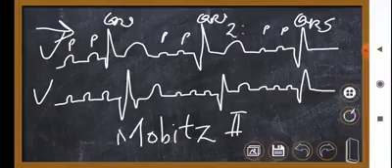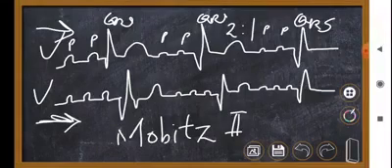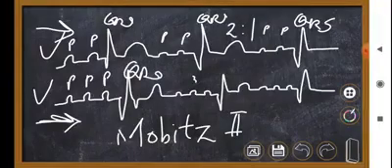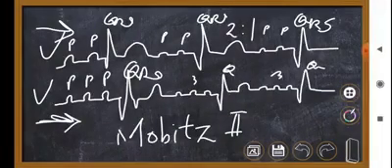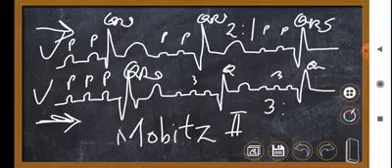Similarly in this ECG, there is a P wave, then again a P wave, the third P wave, and then the QRS complex. Again three P waves and a QRS complex. So here every QRS complex is followed by 3 P waves and it's a 3 to 1 ratio.